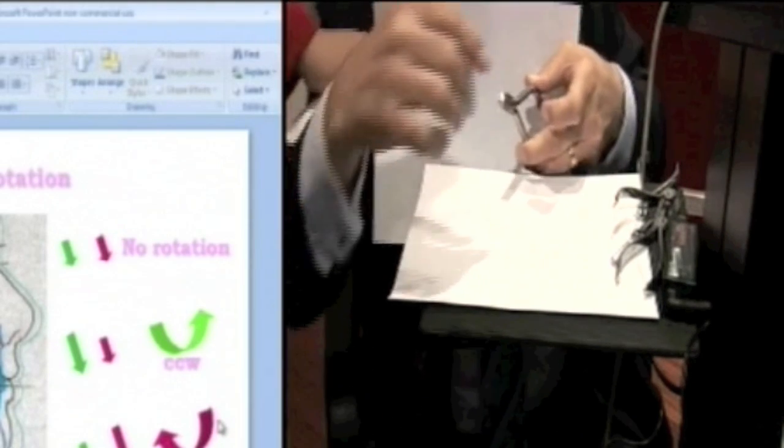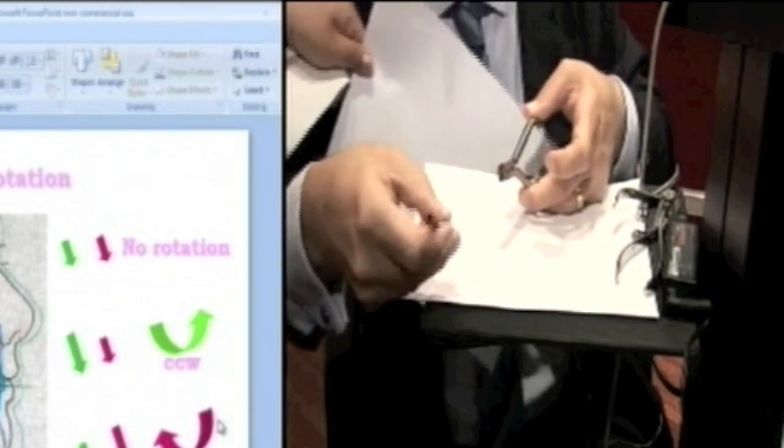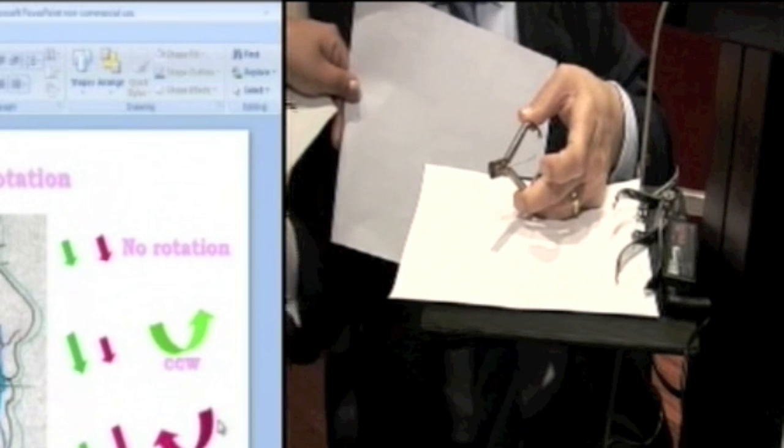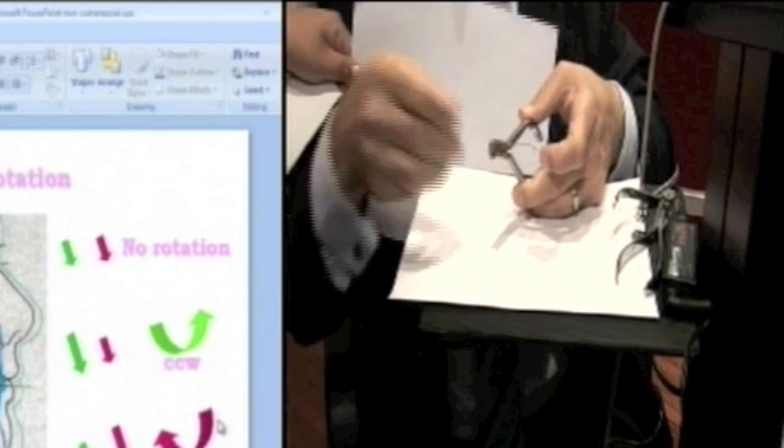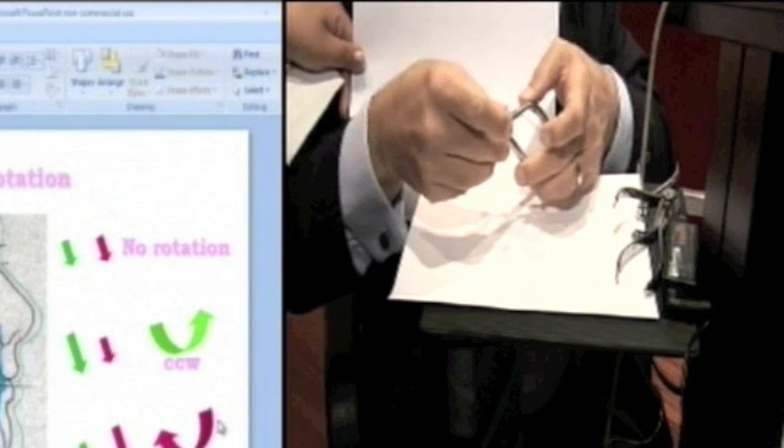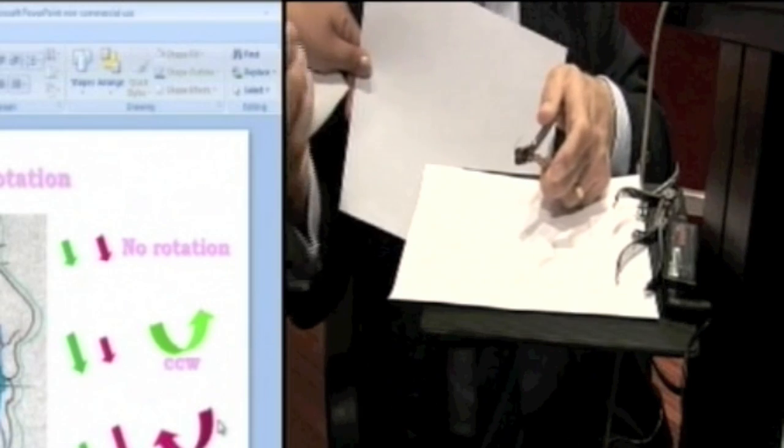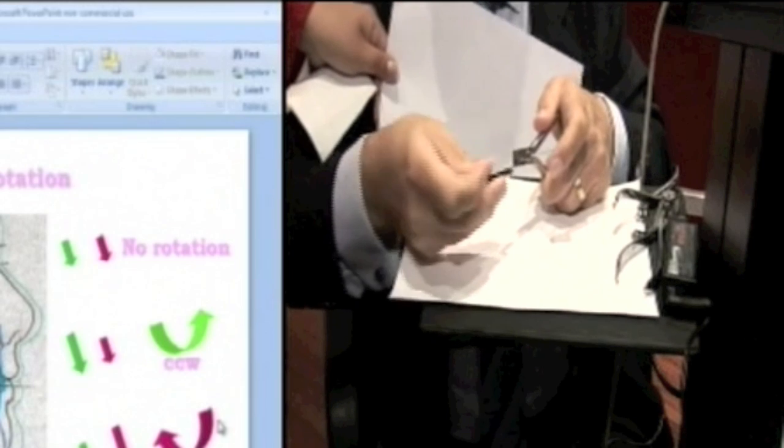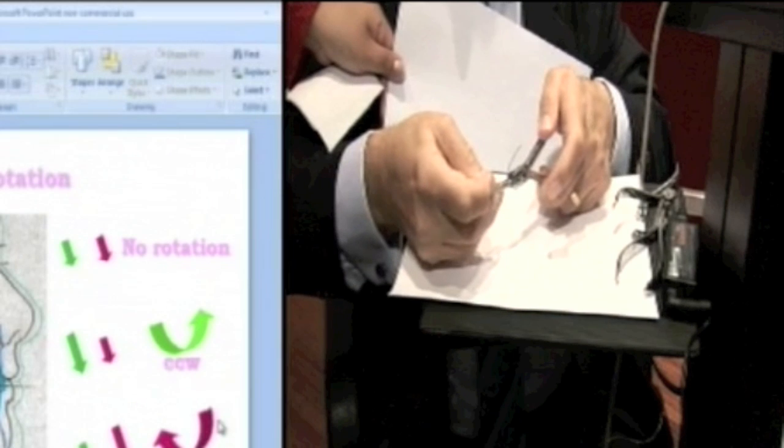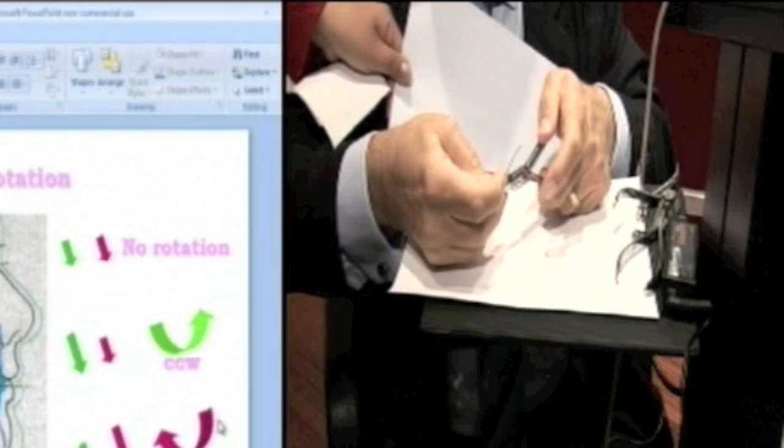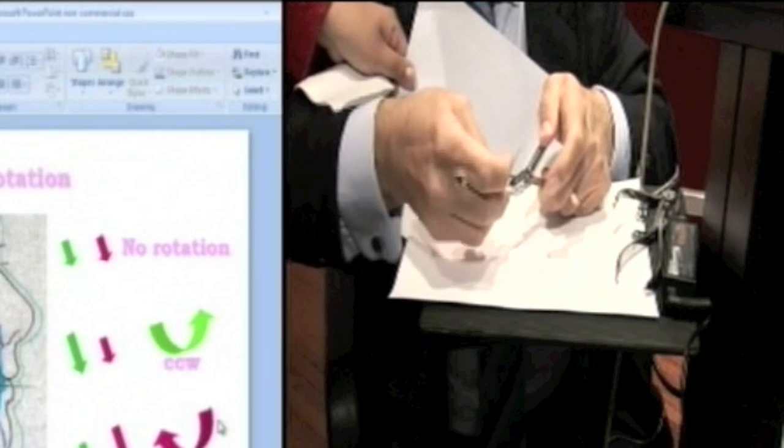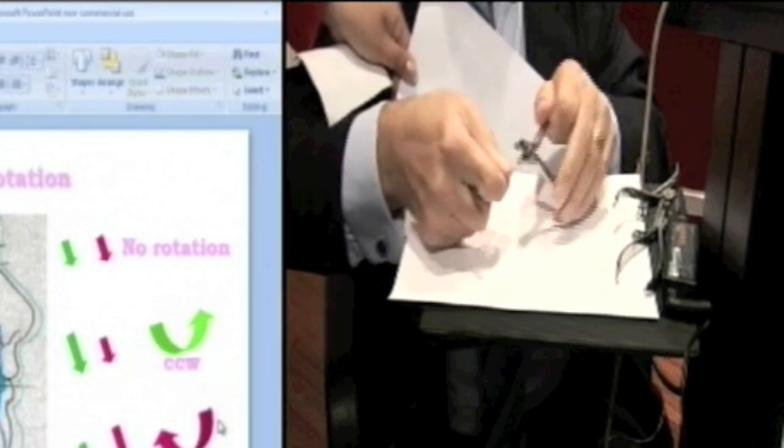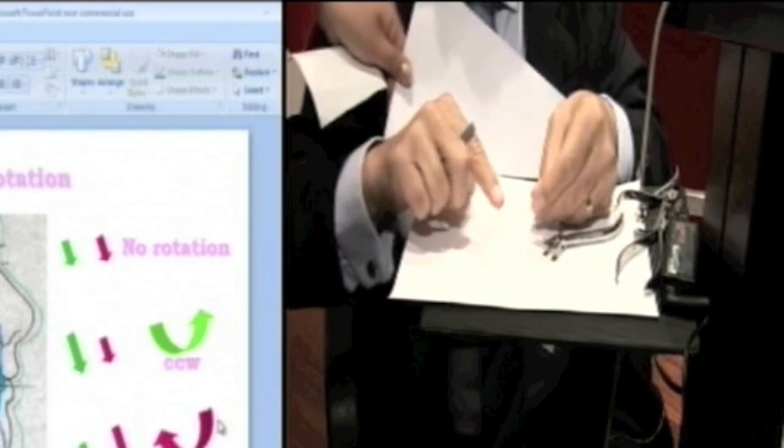You then come in with your torquing wrench. One side is 018, one side is 022. You literally come in to the side that's 022 and it grabs the wire just in the one section. Then holding tightly, you just basically bend that wire. As you bend the wire, the torque is now placed individually there.